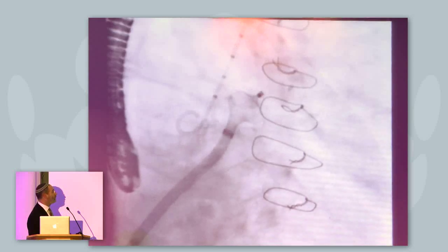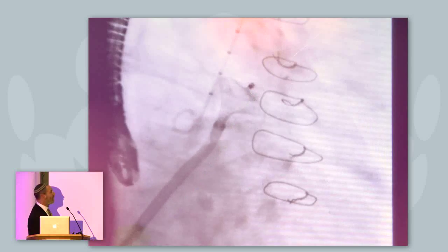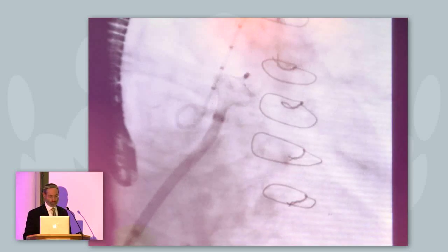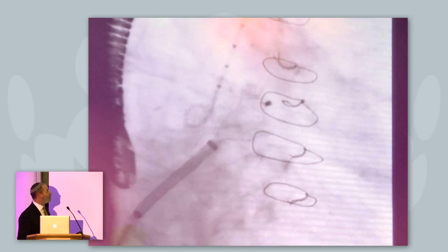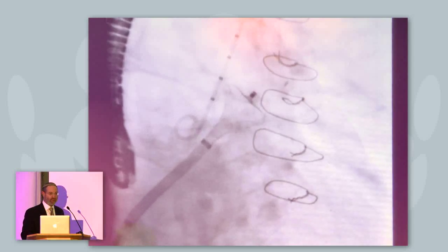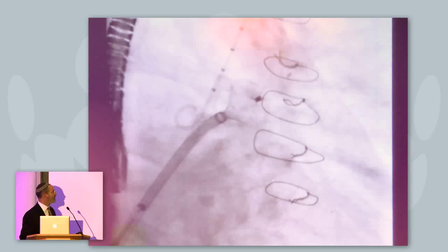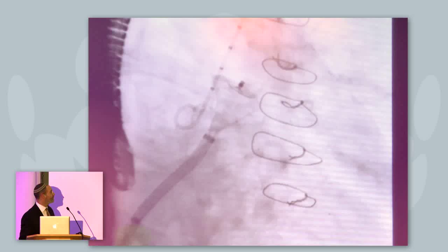I still don't have that room. Extreme counterclockwise rotation to try and achieve that position, and look what happens. It turns my catheter. It's twisting my catheter as I'm trying to release it or trying to advance it. Now I'm pushing it out, and it'll tip as it tries to achieve its position. It's looking for the room, and it just doesn't have that room. Once again, the catheter's changing its position as the device emerges, as the lobe emerges.